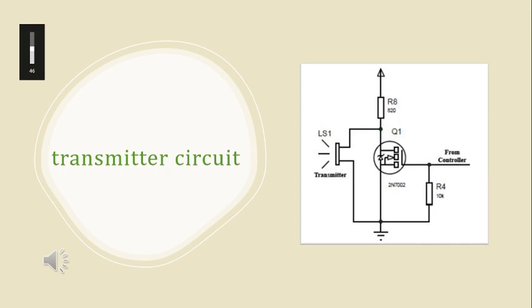After we saw the block diagram of the device, I will start with the first circuit, the transmitter circuit, where this circuit takes the 40 kHz frequency, formed from the fixed amplitude microcontroller, and sends it through its transmitter unit. The figure represents the transmitter unit, which is the piezoelectric transmitter.